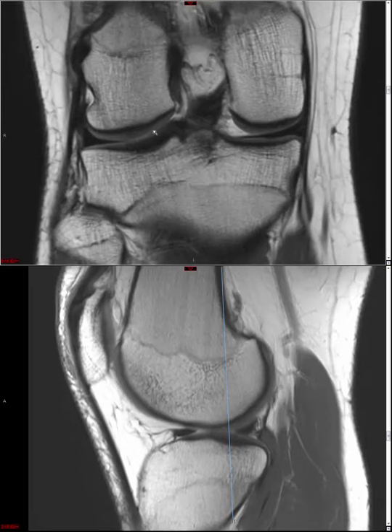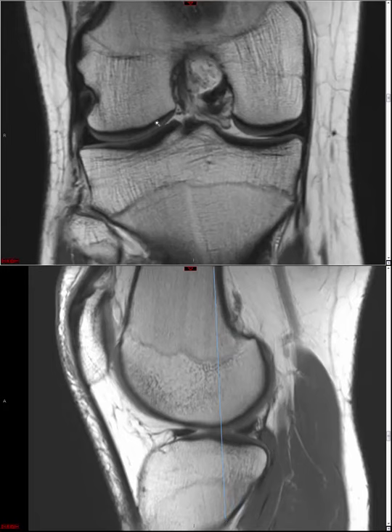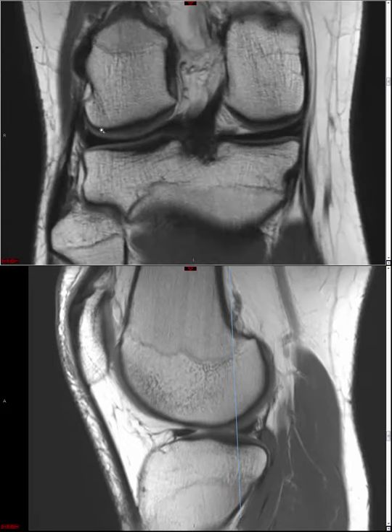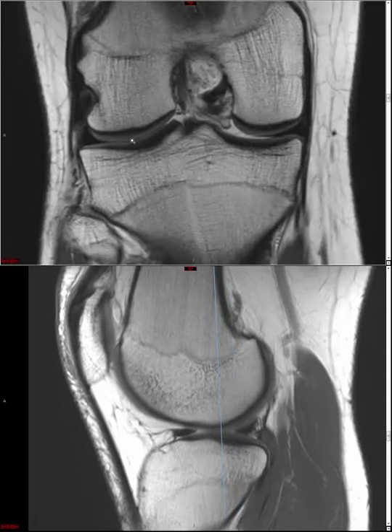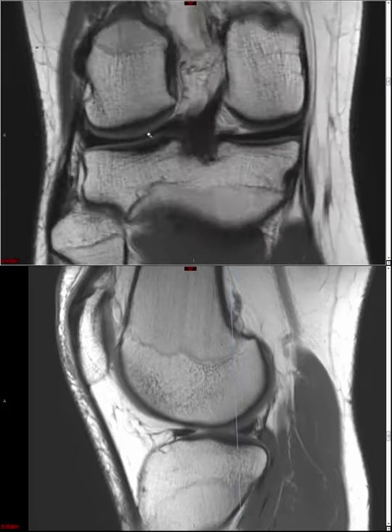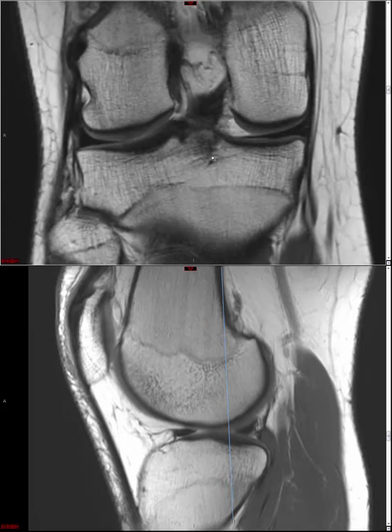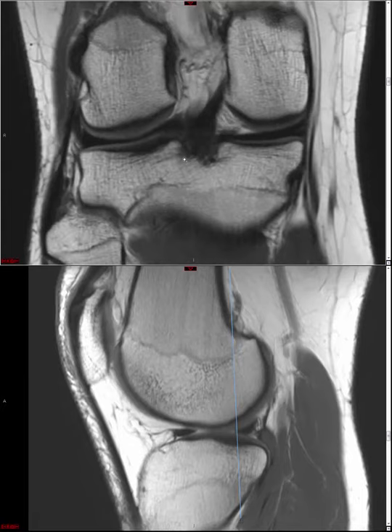So I think there's a tendency to call all of this black subchondral bone plate, but really some of this is actually cartilage. Whether that's simply a reflection of the different orientation of the cartilage molecules, or if it's because of actual differences in composition between the deep cartilage versus the superficial cartilage, we could have discussions about that. But just suffice it to say, understand that there is this kind of gradient appearance of cartilage that's normal, as shown here.